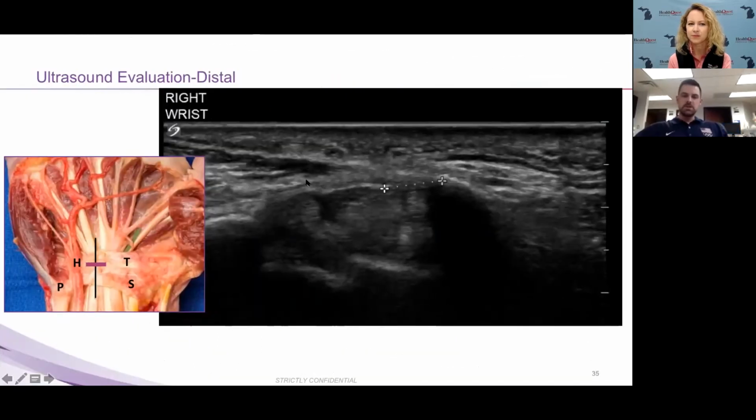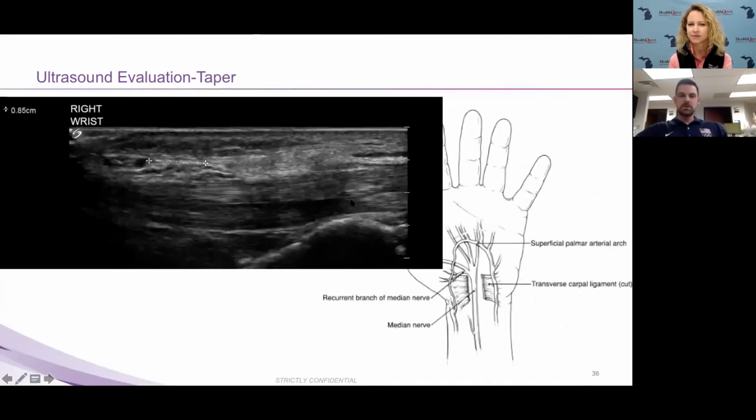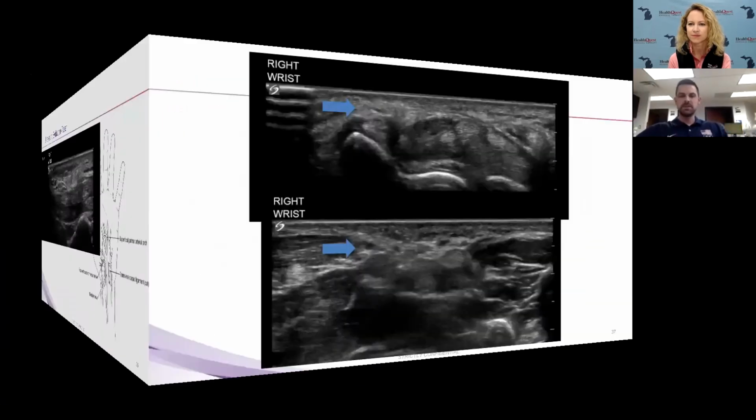And then you slide your probe distally till you're at that kind of distal taper of the transverse carpal ligament, which you can see here coming in and attaching on the hook of the hamate. So I'm measuring my distance from the hook of the hamate to the ulnar edge of the median nerve there. So that's distally. And then when I turn my probe in this back long axis in line with the nerve, you're following it out till you see the superficial palmar arch, right? So the ulnar artery comes up and branches across. And so I've got 0.85 centimeters from, again, here's the TCL, here's the taper of the TCL. So I need to cut from there back, and I need to make sure that I'm not advancing to the level of the superficial palmar arch. So I have measurements of how far I have side to side and how much room I have distally.